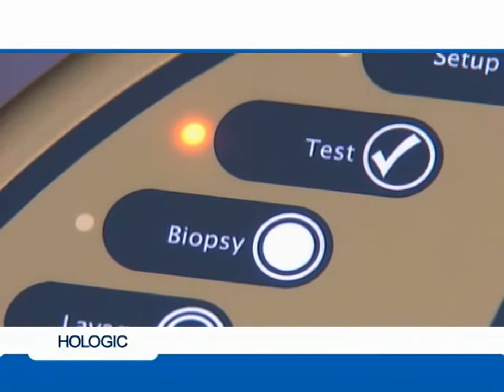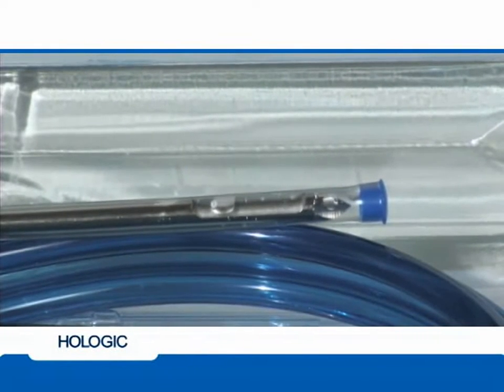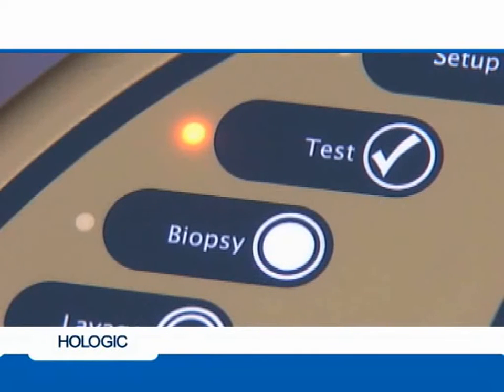Once vacuum and saline are confirmed, push the test button. The console will run one diagnostic cycle. Watch the needle aperture and listen for a whirring sound during this cycle to confirm that the inner cannula advances and rotates. If the inner cannula fails to advance or rotate, initiate troubleshooting steps. Once the test cycle is finished, the console will automatically default to biopsy mode.